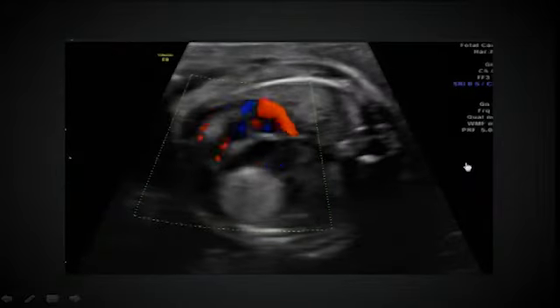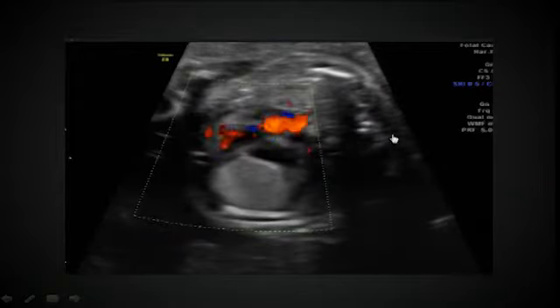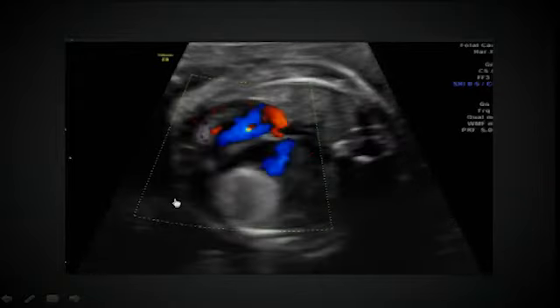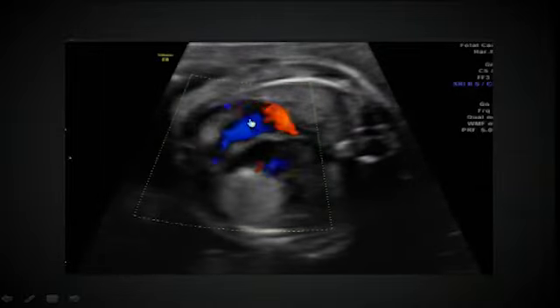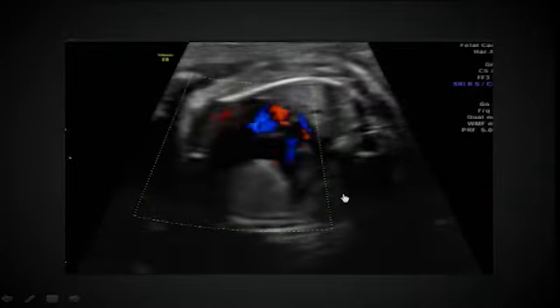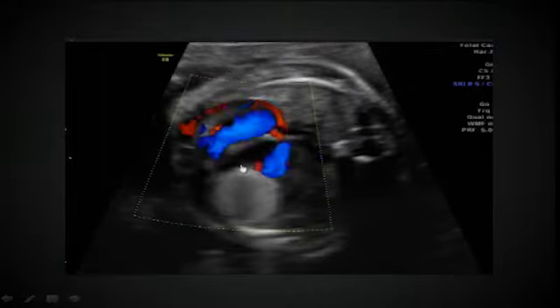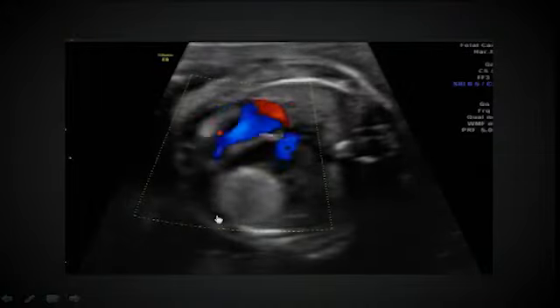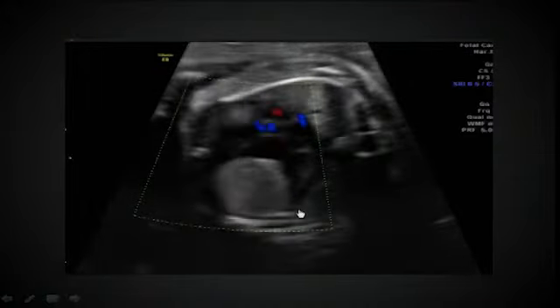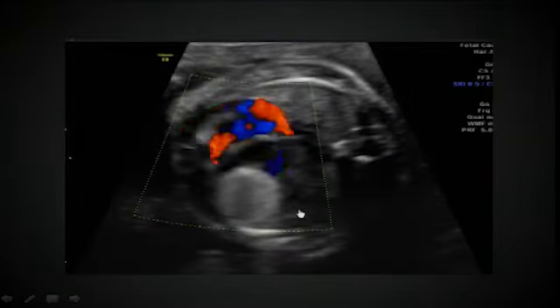And with color. So again, spine here, so posterior to anterior, right to left. Just looking at this color, look at the contractility of that muscle. Do you see how poorly contracting this left ventricle is? It doesn't have that good squeeze. That's what we're looking at. Not only rate and rhythm, but also looking at the contractility of the muscle.